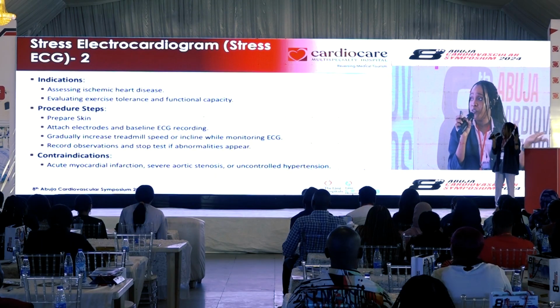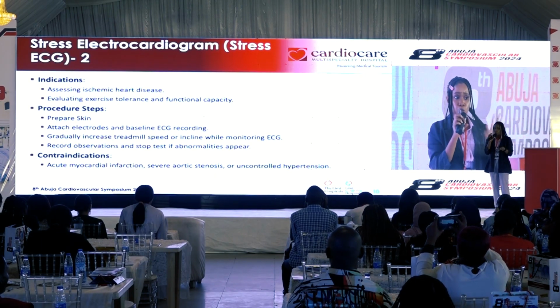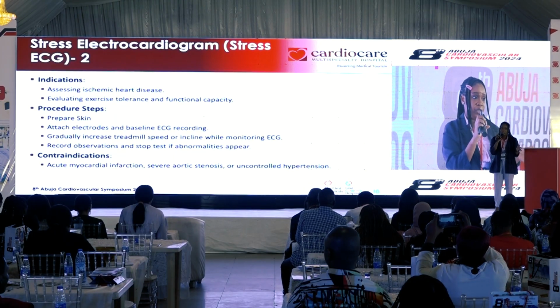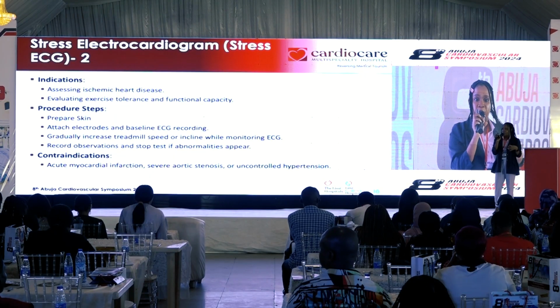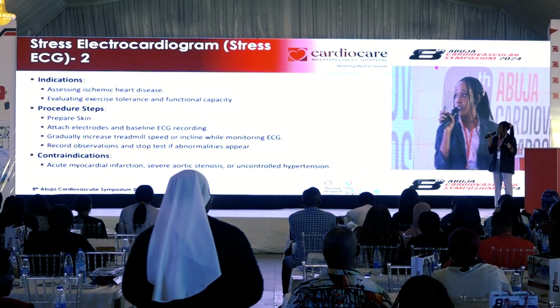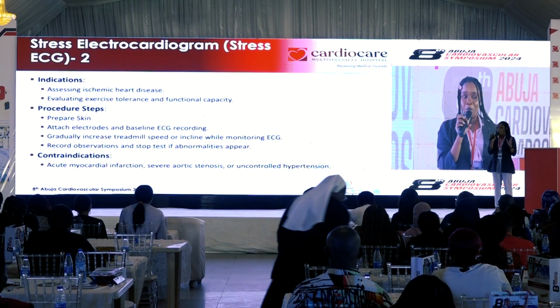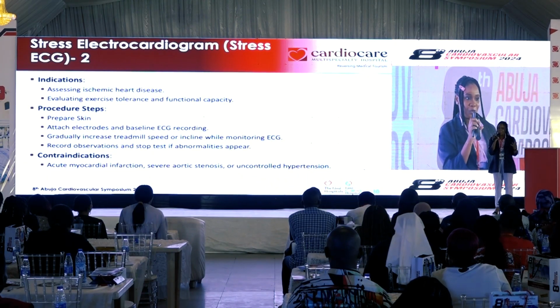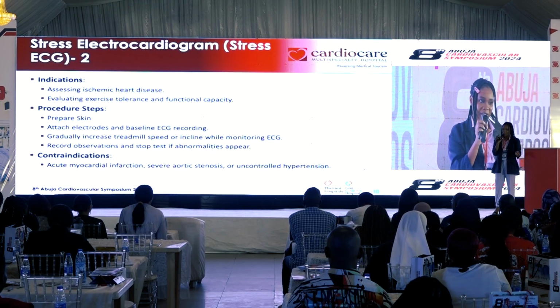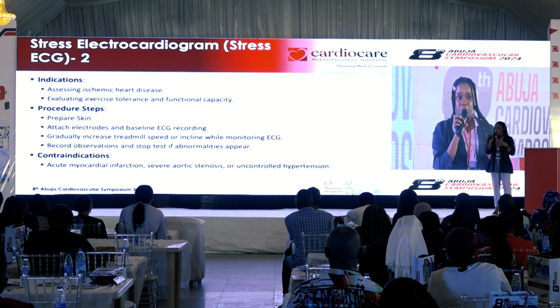So the procedure is pretty much easy. First and foremost, before they come in for the procedure, we've given them prior instructions: they don't take some types of medications, they don't take caffeinated things, and they don't smoke 24 hours prior to the test. Once they come in, they are expected to put on particular outfits. We don't want them to come in wearing a gown to run on the treadmill, which would be very detrimental to them. So we tell them the proper outfits to put on. They come in for the test.